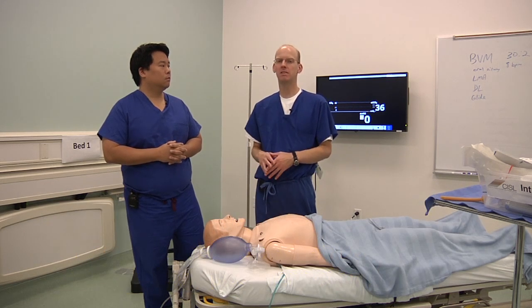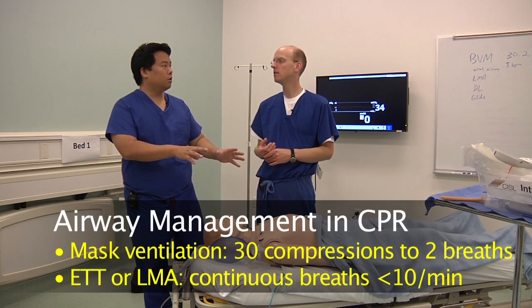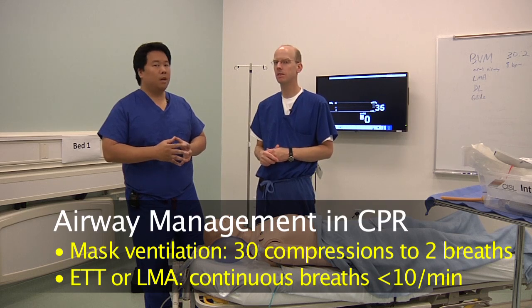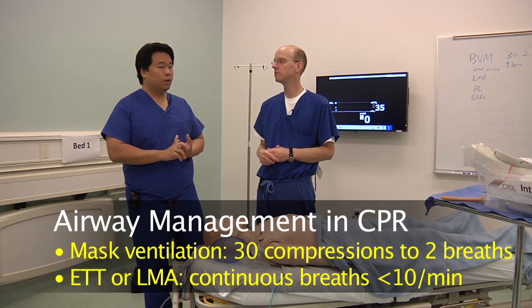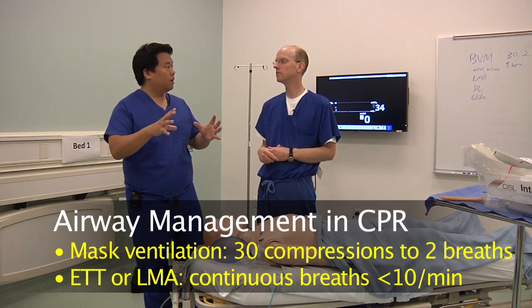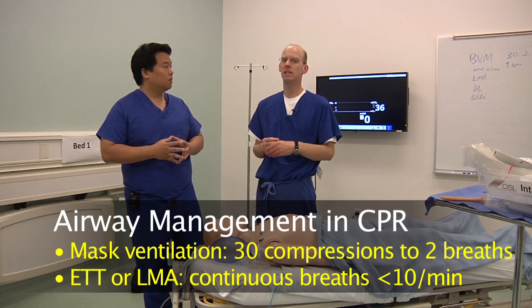If you're doing bag mask ventilation, you still need to coordinate the 30 to 2. So it's 30 chest compressions to 2 positive pressure mask ventilations. But if you do an advanced airway technique, or you are able to secure the airway with a tracheal tube or a laryngeal mask airway, then you can give breaths during chest compressions. Right. Continuous compressions. And the rate? And the rate, definitely less than 10. I shoot for around 6. It's actually very hard to do.